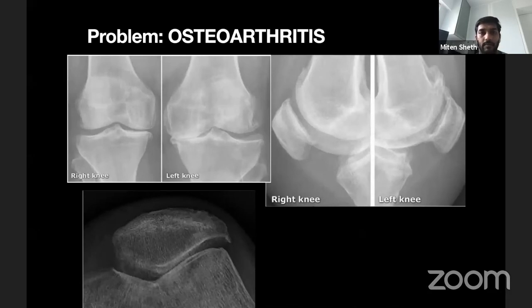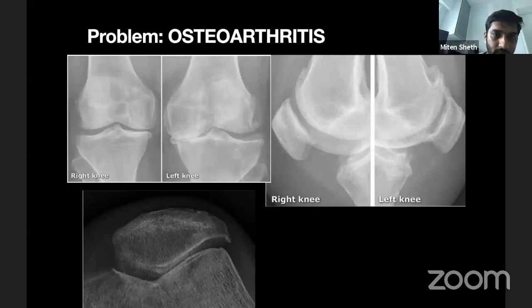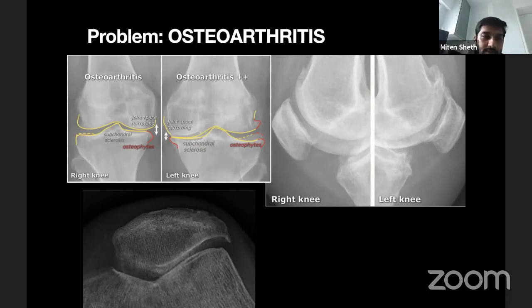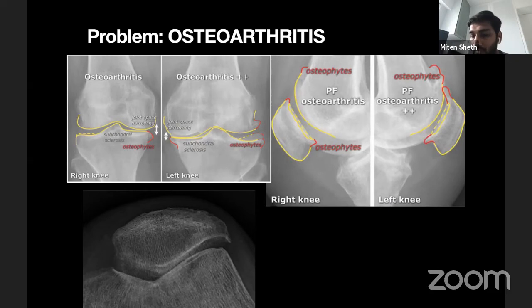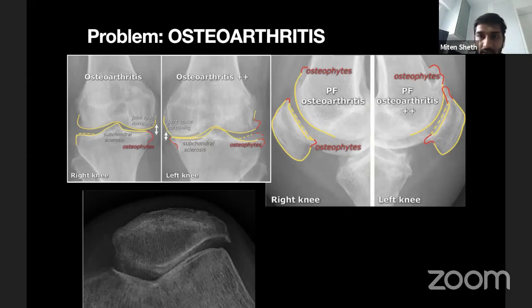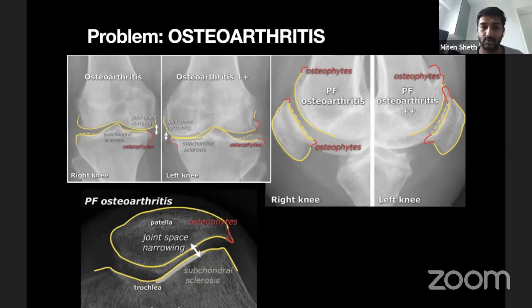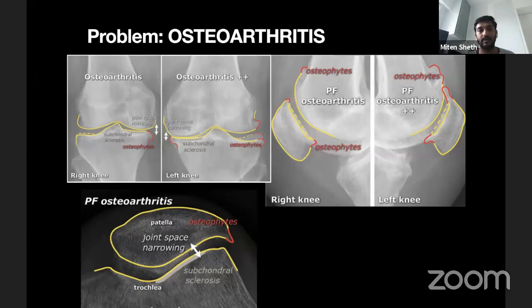When assessing arthritis, standing X-rays are mandatory. Look for joint space narrowing and osteophytes — subchondral sclerosis follows. In clinical practice, rather than grading by Kellgren-Lawrence grade 1 through 4, we simply want to know whether it is bone-on-bone — meaning all cartilage and meniscus between the joint has been destroyed — because treatment depends on that distinction.